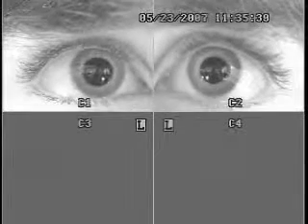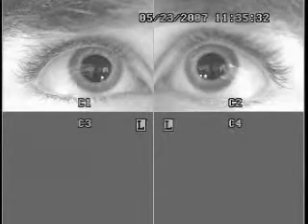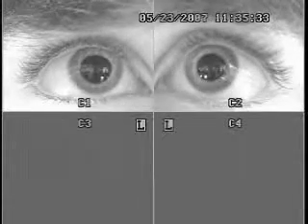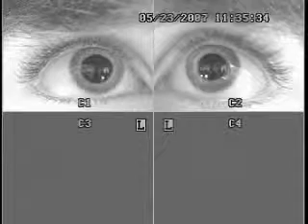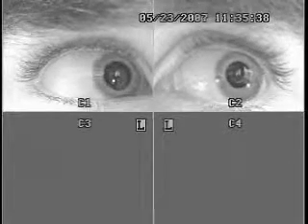So, now the actual test. Follow the bead with your eyes and your eyes only. We're going to check for lack of smooth pursuit.